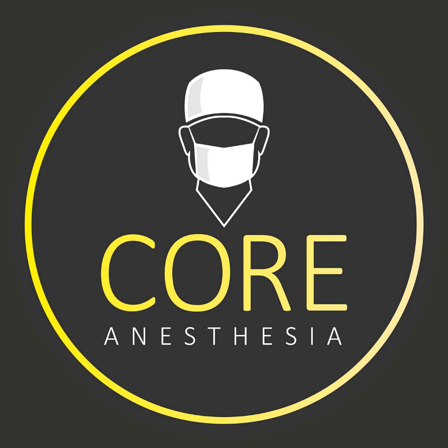Each provider is going to have a preference on what equipment they're using, whether it's going to be a Mac or a Miller. Those are going to be the two most common blades that we'll talk about. So I just want to take a minute here to touch base on that as well. A Mac blade is going to be curved. A Miller blade is going to be straight, and that's the biggest difference between the two.